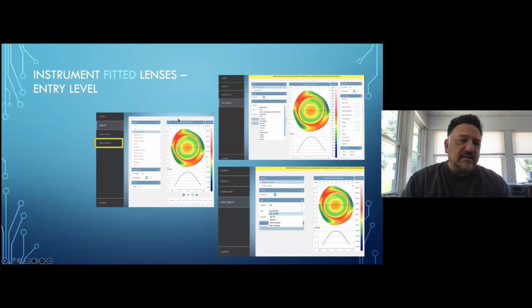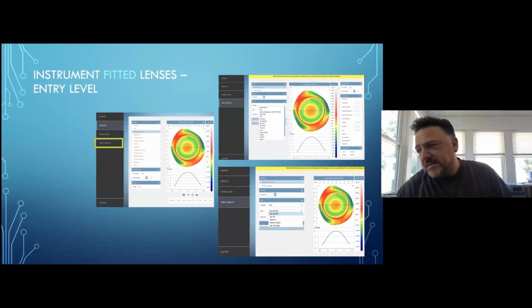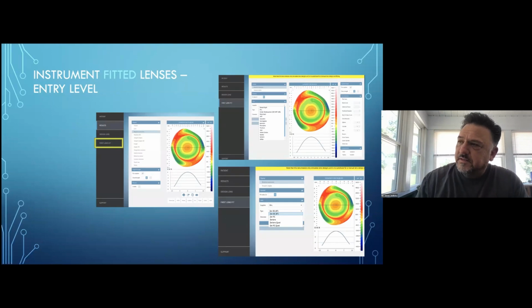So that's the idea of instrument aided fitting. It is the same process as diagnostic fitting, but instead of just using pure intuition and grabbing a lens from my fitting set that may or may not work well, or may or may not be the best lens in my set, it allows me, with the time it takes to get a scan of the eye, to then pick the best lens out of my fitting set the first time, 90+% of the time, and make that process extremely efficient for both me and for the patient.